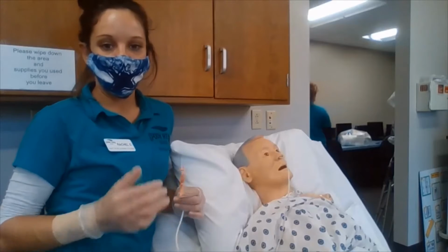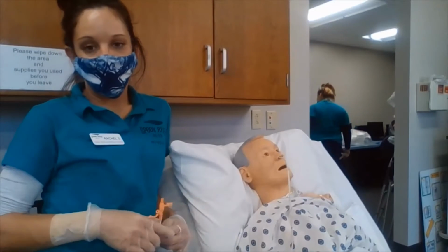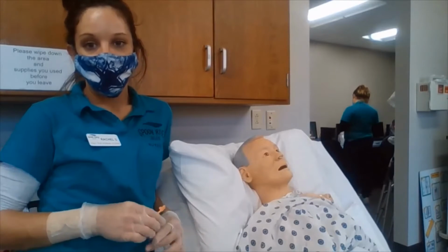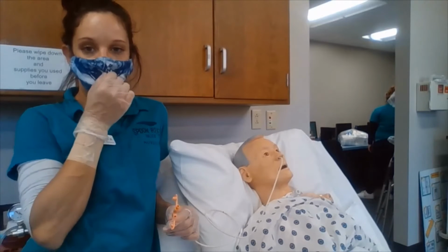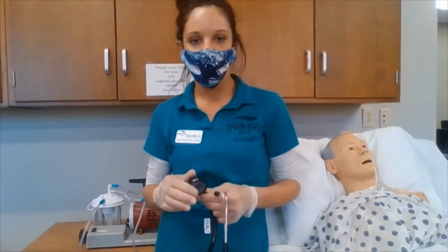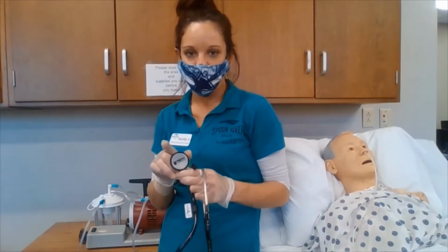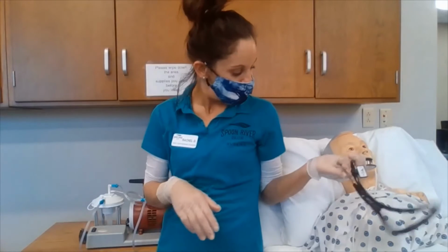If the tubing is coiled in the patient's back of their throat, if they are coughing and gagging excessively, or they develop respiratory distress, we then will remove the tubing, give them a break, and then we would try the procedure again.